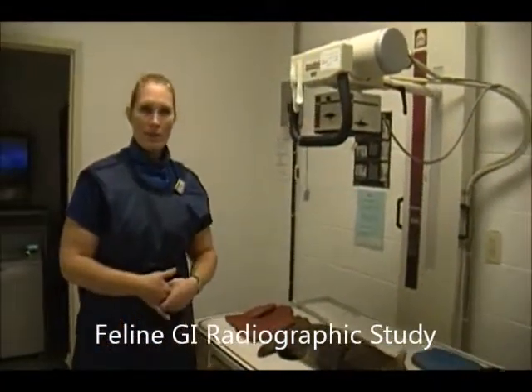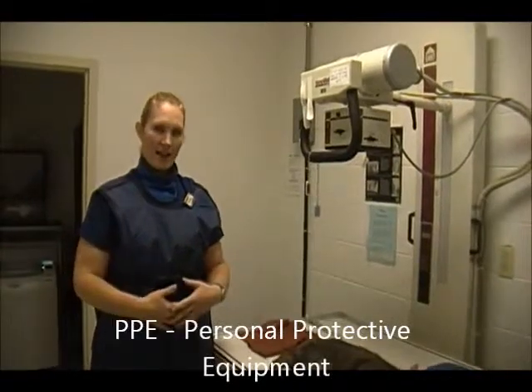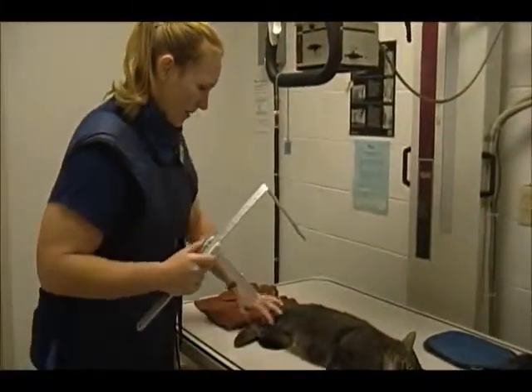Before we start, when we're in the radiology room, we want to have our PPE on. We're going to have our lead gowns, our dosimeter, and our thyroid patches. We're going to start by doing a measurement for the VD.